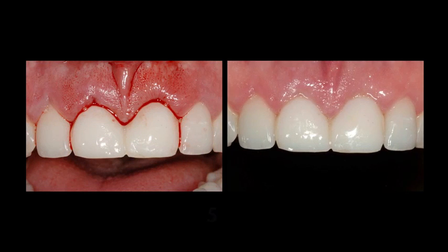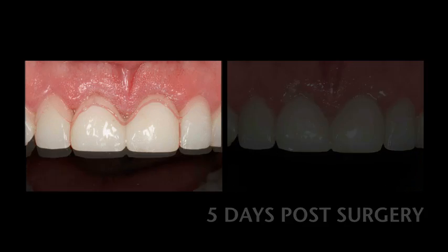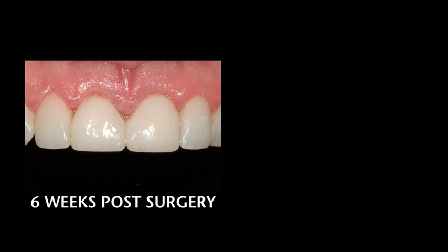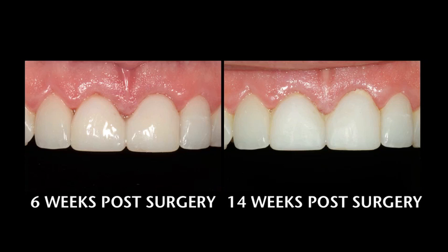And here we are basically 5 days post-surgery, and everything looks amazing, but you have to keep in mind that you'll have some bone remodeling and tissue shrinkage and remodeling as the case heals. So here we are at 6 weeks, and it still looks quite good. We've had a little shrinkage and a little bone remodeling, but overall it looks quite good. And here we are at 14 weeks post-surgery.